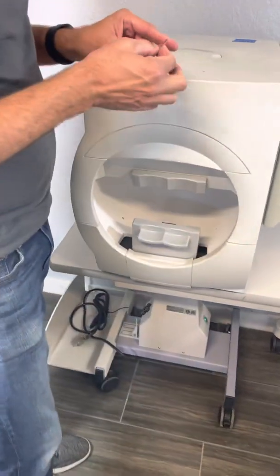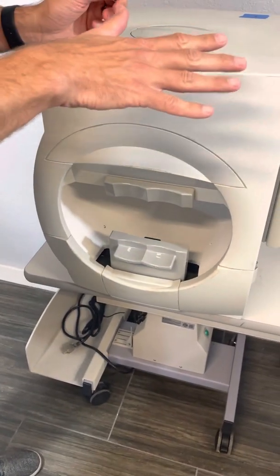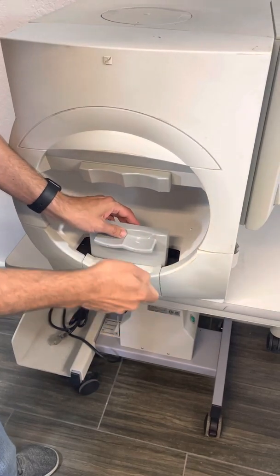Once you get to your machine, raise the chin rest all the way up and then turn off your machine. Your chin rest more than likely is going to be loose or comes off.